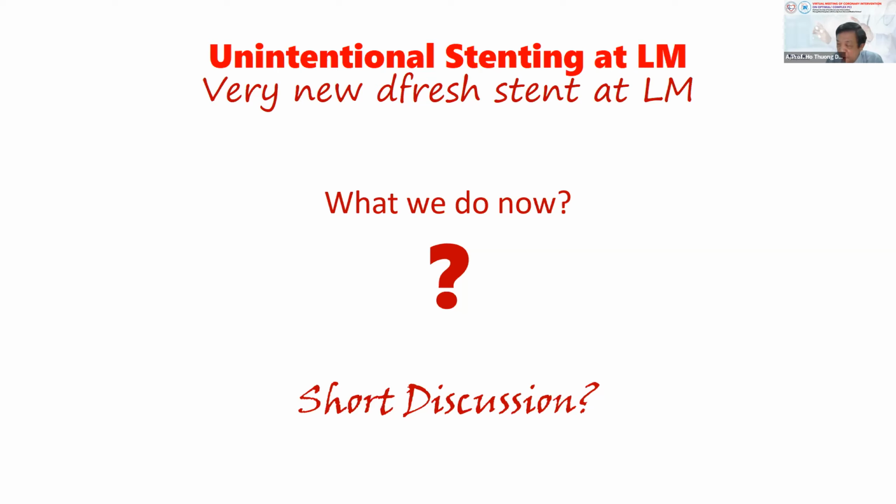Yeah. Thank you so much, Dr. Pinto. Maybe one opinion from the other panelists from Vietnam. Dr. Ngô Minh Hùng. Yes, a very complicated case, really. So actually we are out of our plan as we said before we did the procedure. So now we have to save the patient's life first, as you did, in order to stabilize the patient. Now you're asking about the proximal LAD, a very calcified lesion behind the stent. In this situation, as Dr. Pinto already mentioned, you use a smaller balloon or multiple ballooning.